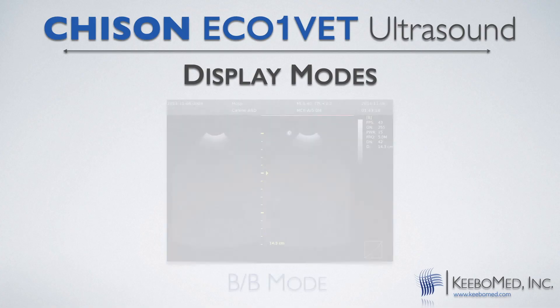The Eco One Vette has clear, detailed black and white images and has four different display modes.